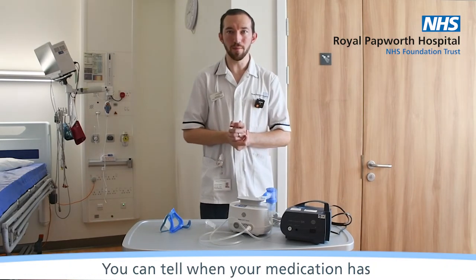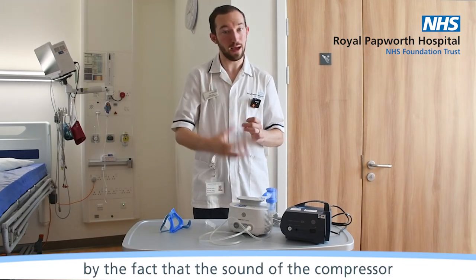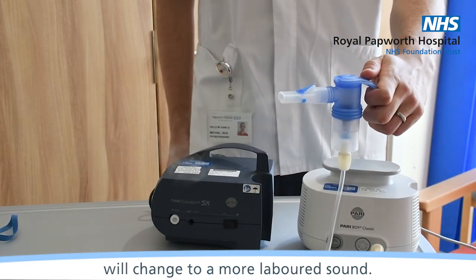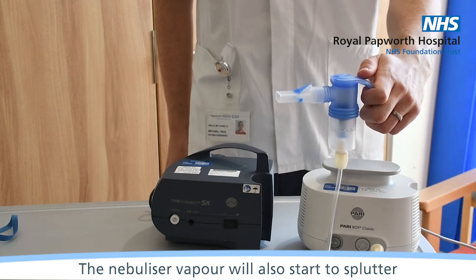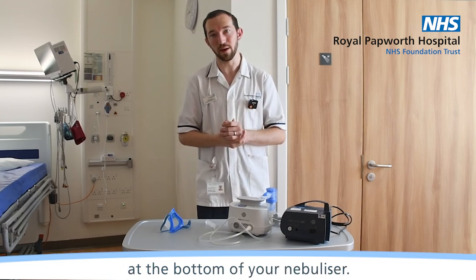You can tell when your medication has finished going through the nebuliser by the fact that the sound of the compressor will change to a more laboured sound. The nebuliser vapour will also start to splutter, but there will still be a little bit of solution at the bottom of your nebuliser.